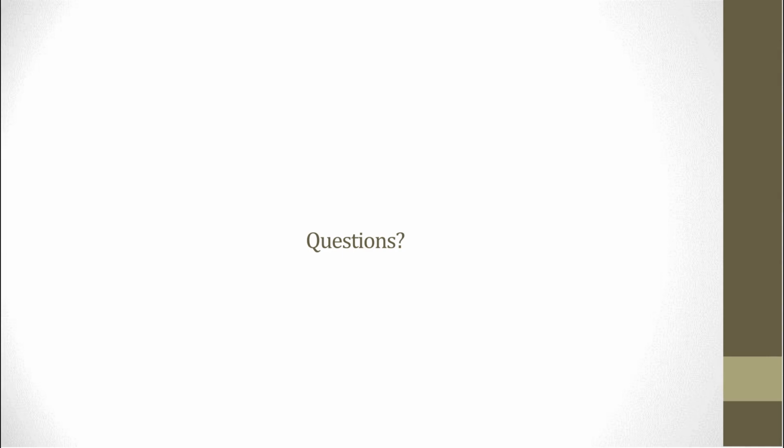Right. Thank you. Next question is, can we use customized panels from third parties, or does it have to be through Thermo Fisher? So from my understanding, for the usage of Oncomine Reporter, the VCF file that is generated needs to come through either the Ion Reporter platform or the Genexus platform. So whatever data is being generated, in order to push that through Oncomine Reporter, would have to be analyzed in either of those platforms.